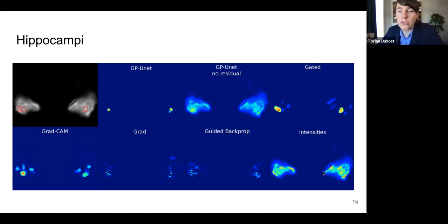This is if you would use the intensity directly to quantify perivascular spaces. Maybe you want to trace, because perivascular spaces appear as hyperintense on the image. So you could say, okay, I want to do a threshold on the intensities, and that's going to give me a pretty good estimate of the load of enlarged perivascular spaces, provided I have segmented my region of interest. Well, yeah, it doesn't work that well, again because of these little hyperintense regions that are not perivascular spaces.